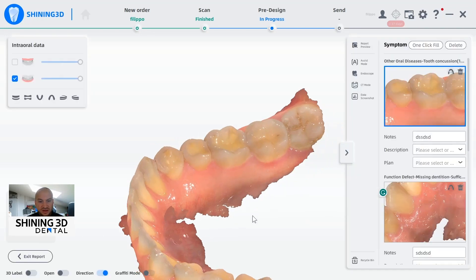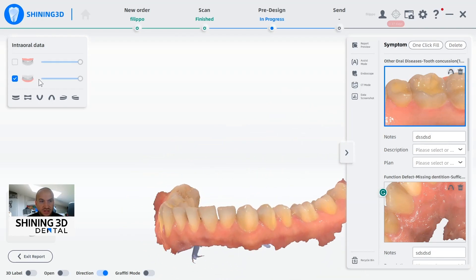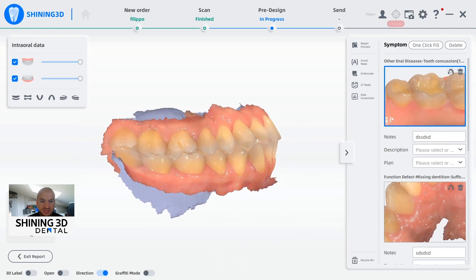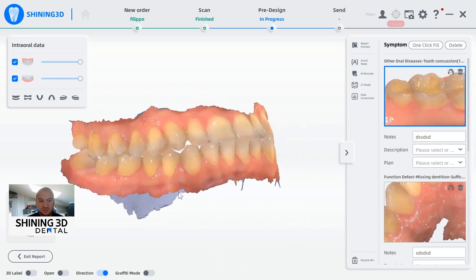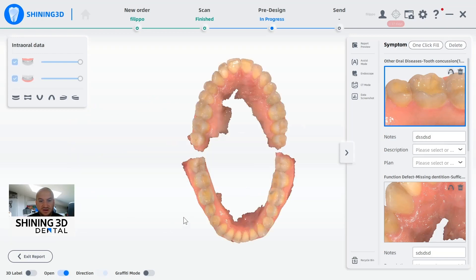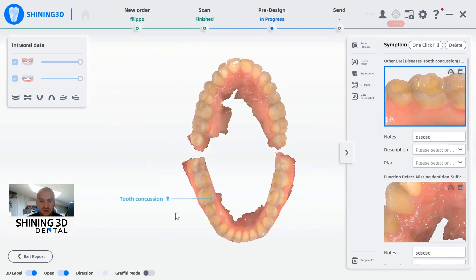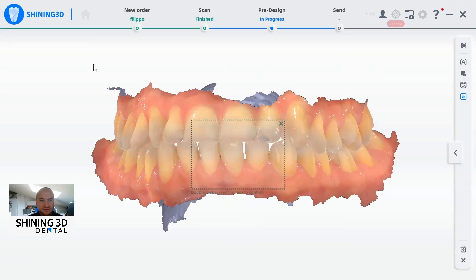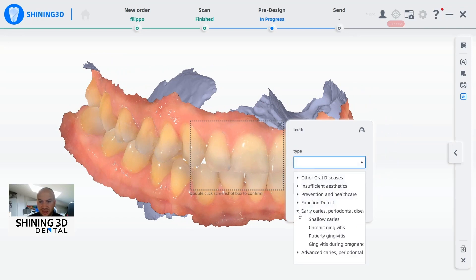We now also have the possibility to turn on the direction of what we are seeing on the monitor. We have the possibility, as you can see, to see in real time the orientation of the arches with the reference of the head. We have the possibility to see the arches open, and we can add the 3D label. According to what we highlighted in the previous step, we now have the possibility to see the 3D label.